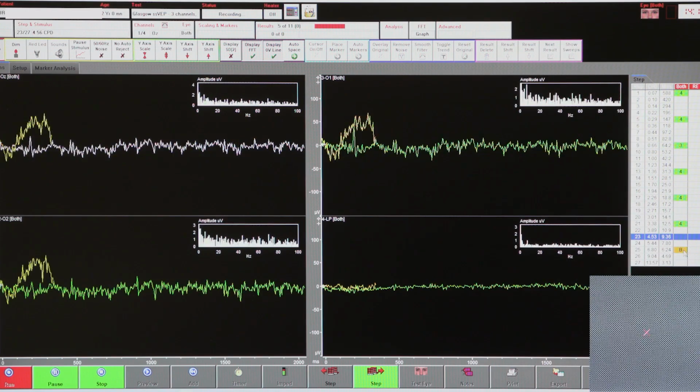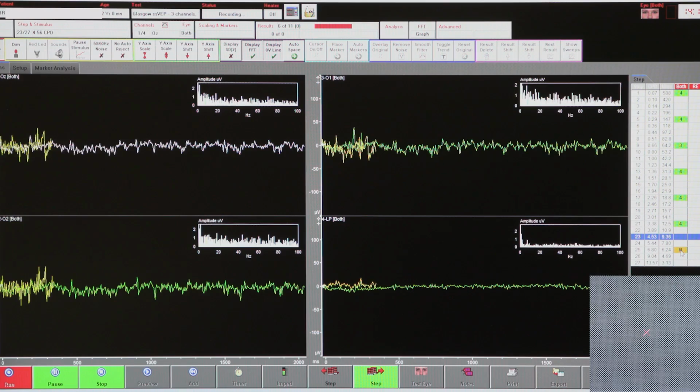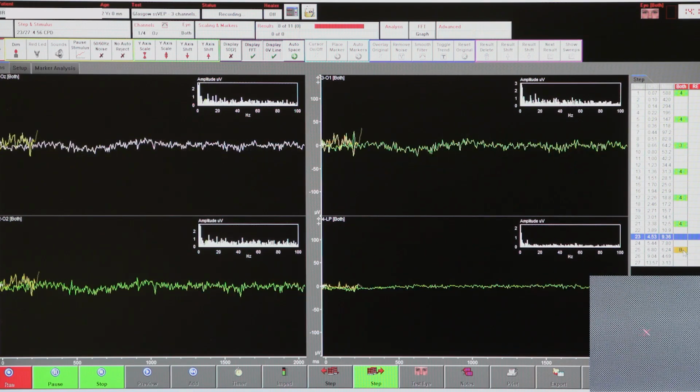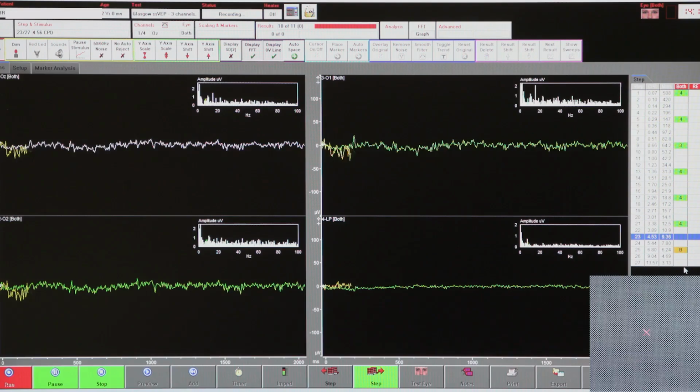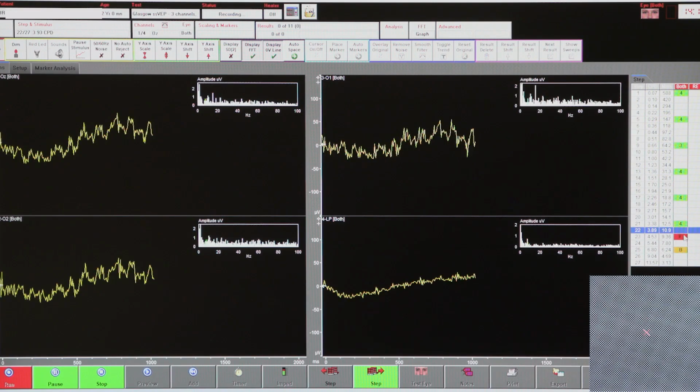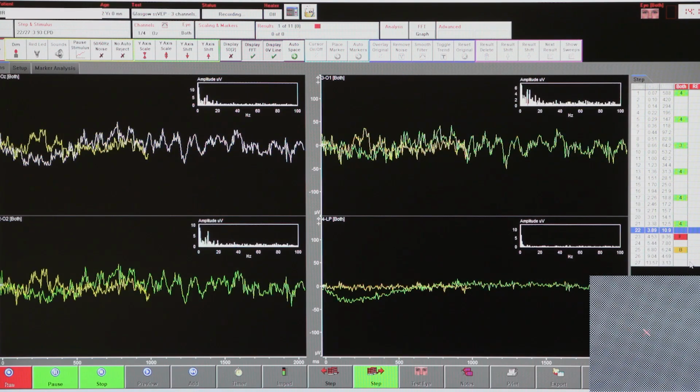There we have an amber result, same as a red as far as the algorithm is concerned, i.e. no VEP is present, but with a close to statistically significant result, as we already talked about. We will therefore jump up 2 steps. No VEP detected there, hence red.